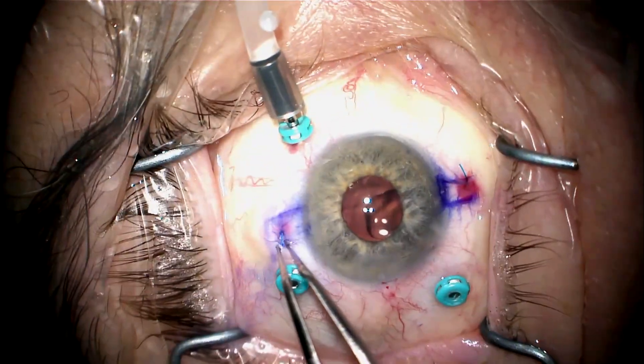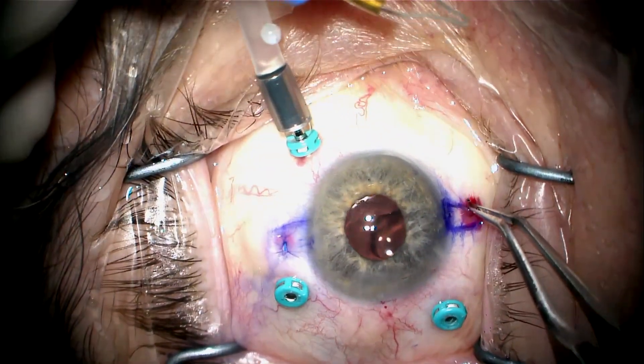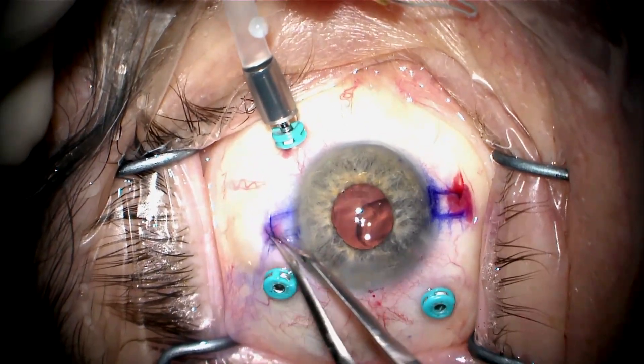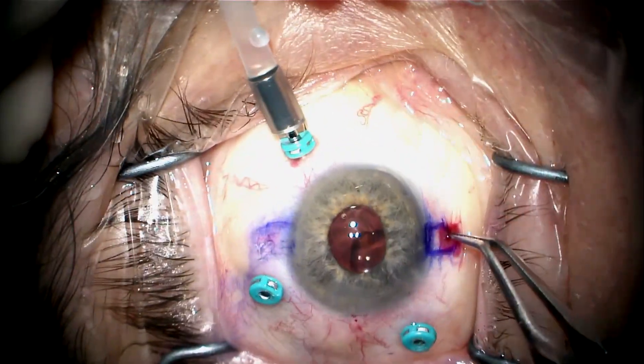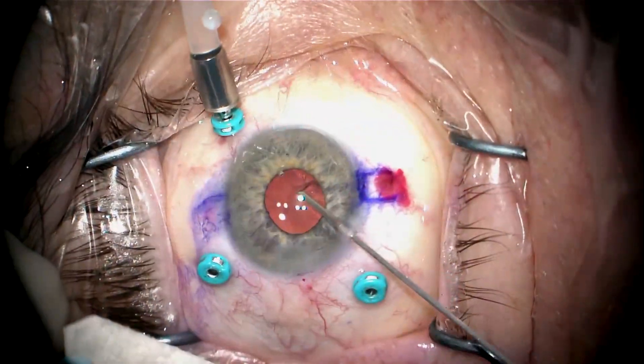I'm going to melt a little flange and push this in. On the other side, I melt the flange and push it in as well. It's very important to push the tip of the flange all the way in as much as possible and make sure the conjunctiva and Tenon's capsule move freely over the tip of the flange.